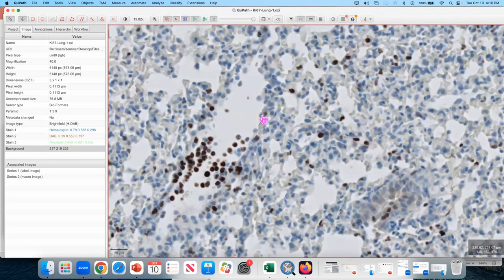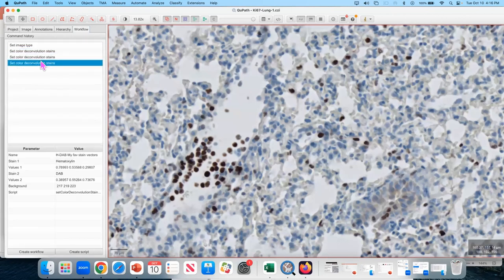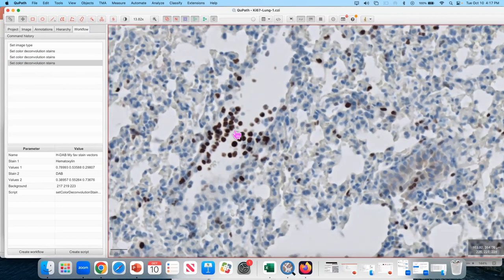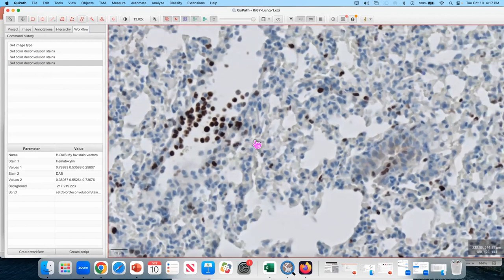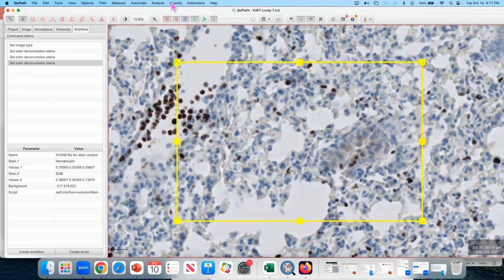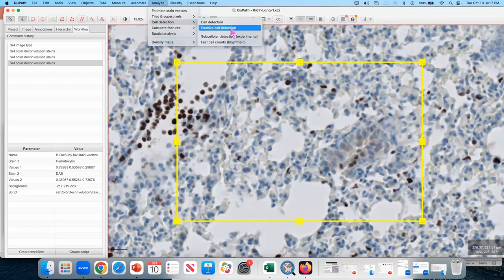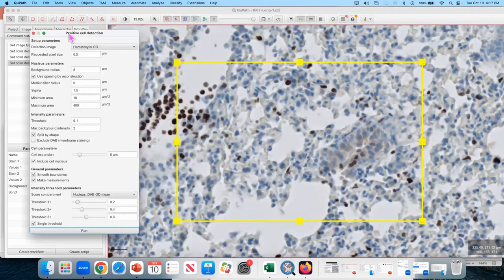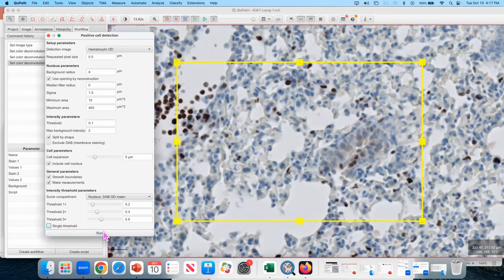So let's try to optimize an H-score measurement, and you can choose any image that you want for that. Let's do it in a small region of interest initially. Analyze cell detection, positive cell detection. Let's try with default settings and see what we got.